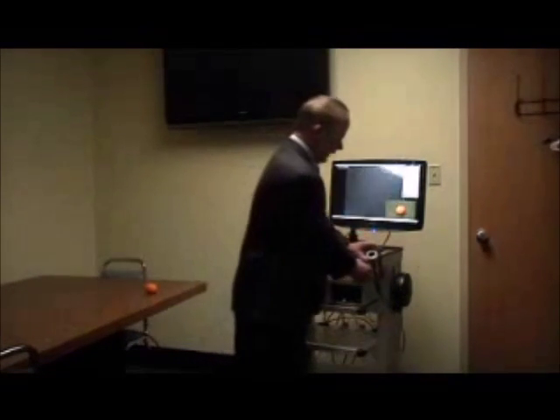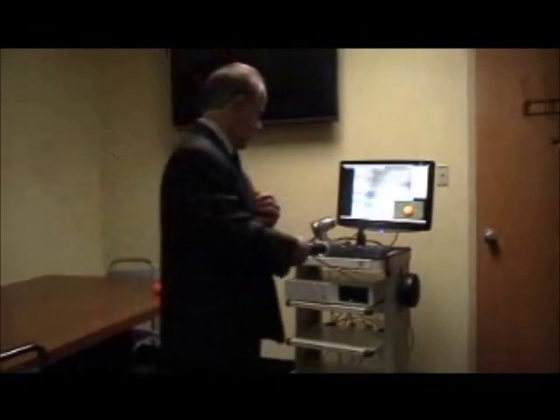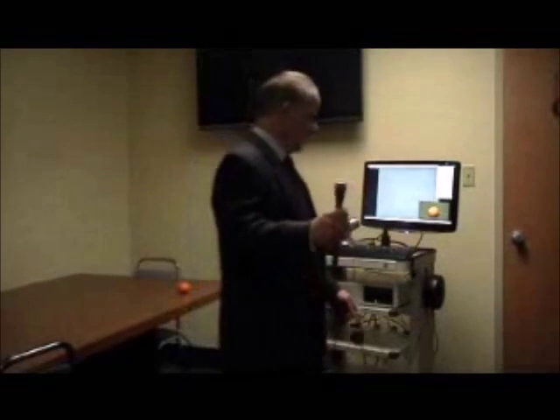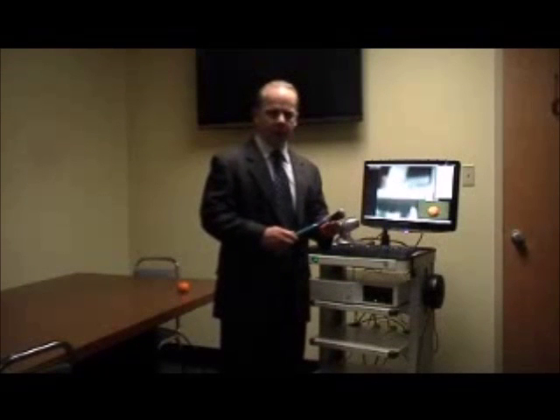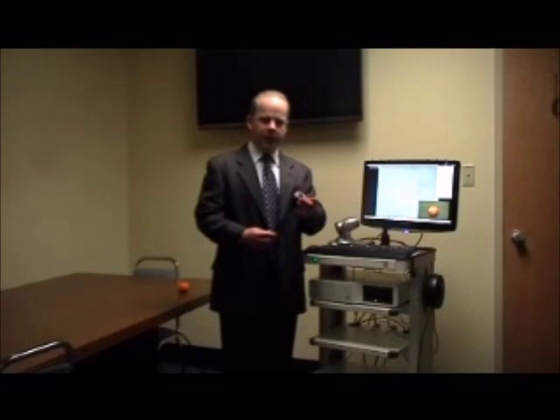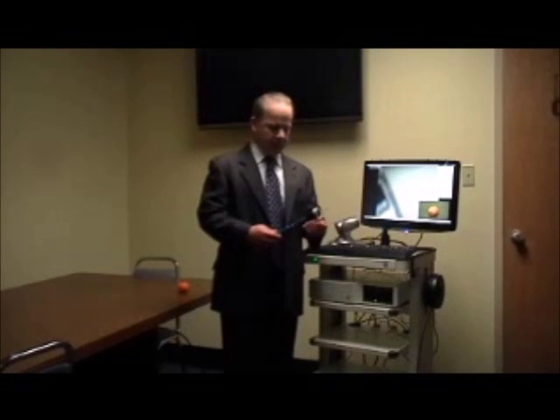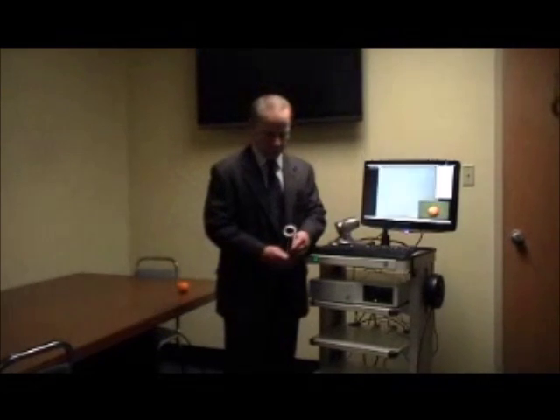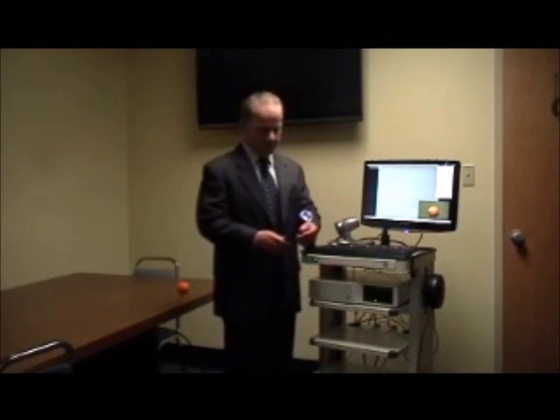So then you can take the other camera, which can be the close-in handheld camera, which is on a retractable reel, so it can be pulled away from the actual cart up to 15 feet away from the cart. And this handheld camera is medical grade, FDA cleared, with disposable heads on it, so you can touch the patient's skin with the head of the camera and dispose the cap here when done. It's also got a focus ring and a light source which has 3 levels of intensity on it. So we're going to go ahead and crank it up to maximum intensity here.